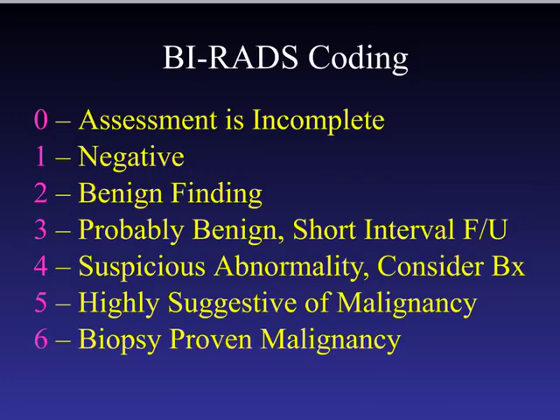If we have a finding that we think we need additional imaging in order to better evaluate that finding, we will code this study as a BI-RADS 0, which means that the assessment is incomplete. Once we state this, this means we either need to bring the patient back for additional pictures, or we need to get prior imaging in order to compare the current study to old exams. This happens most frequently at the time of the screening mammogram interpretation.